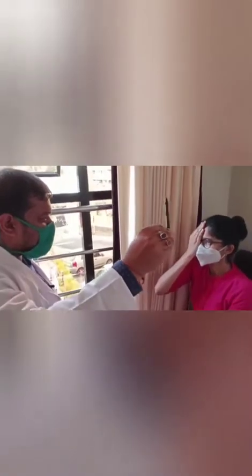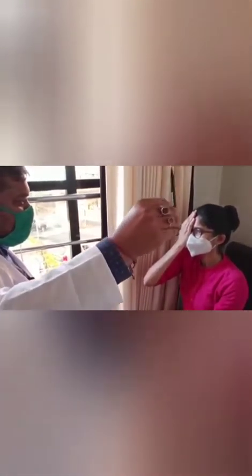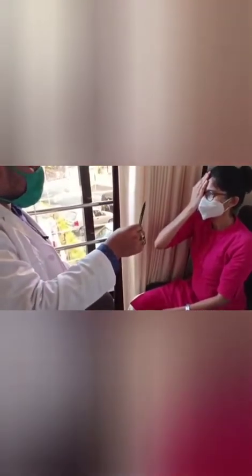Now just follow this. Okay. And tape. Okay. Is it visible? Yeah. Okay. So tell me when it is visible. Okay, visible. Till now it is visible, correct? Yeah. Here. Visible, correct? Okay. Here. Okay.